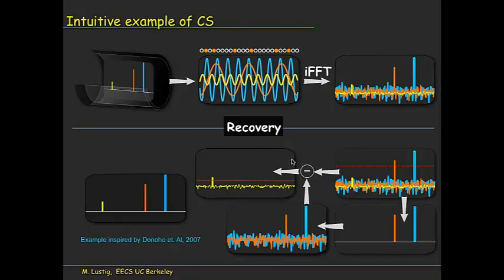Now this is an intuitive example. There are some faults to my description. For example, these are also corrupted by interference, but that is the basic idea, and they can be solved. And this idea also comes from digital communication, like your cell phone when it communicates with the base station, operating in a very similar way.